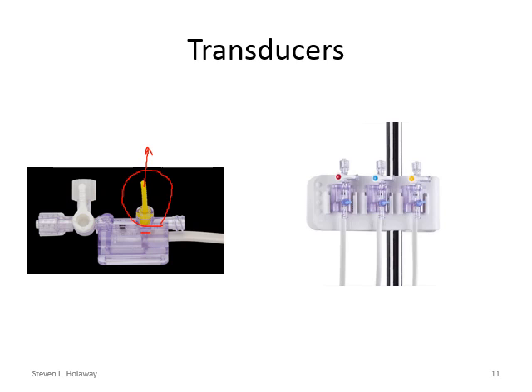When you're working with a patient that has multiple hemodynamic pressure sites, they're labeled. Typically red means arterial. Blue is CVP, and yellow is typically the PA site. I'm sorry that didn't change colors, but that's okay. It's PA. From that site you can also do the wedge pressure, and we'll talk about that a little bit later.